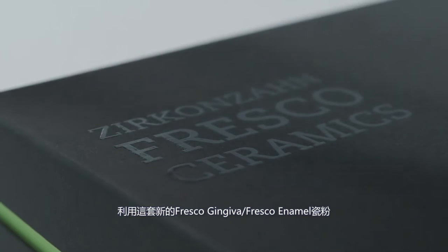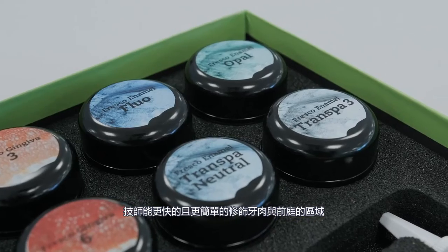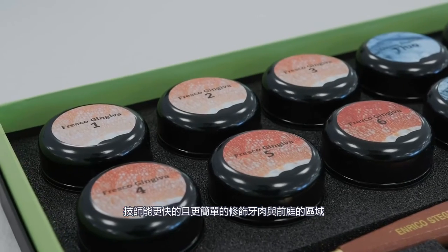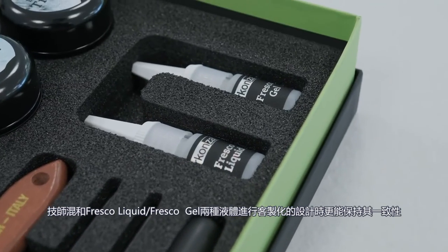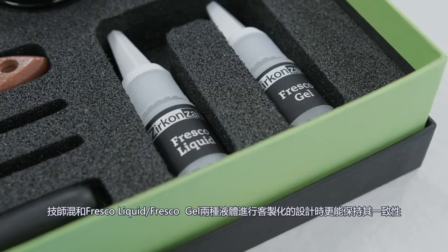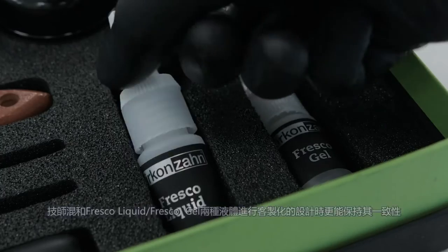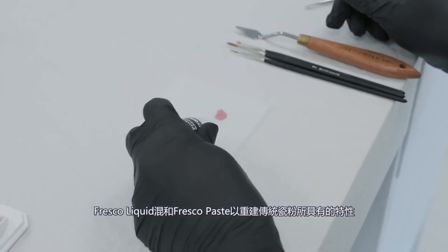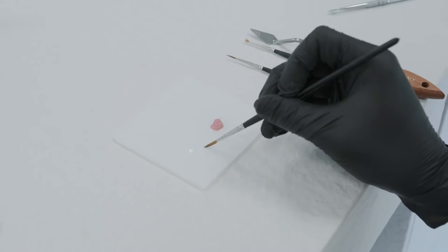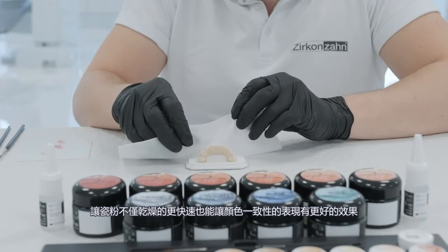With the new ceramic pastes Fresco Gingiva and Fresco Enamel, it is now possible to quickly and easily veneer in the gingival and vestibular regions. The consistency of the pastes can be further personalized by adding the two mixing liquids: Fresco Liquid and Fresco Gel. Fresco Liquid is mixed with the Fresco pastes to recreate the positive properties of conventional ceramics.